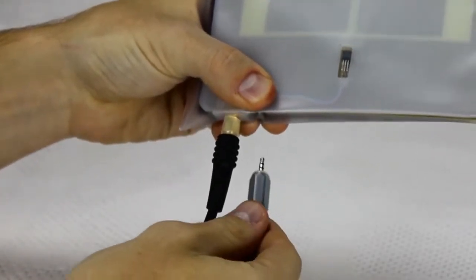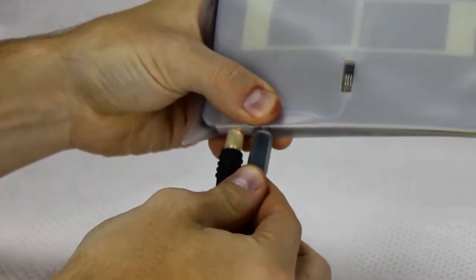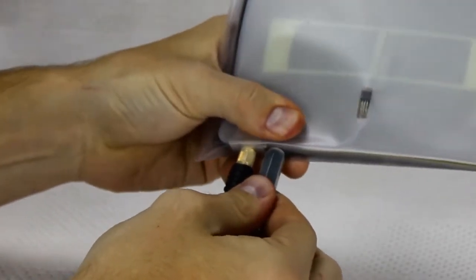To connect the gray cord, plug it into the hole next to the black cord. Next, connect the cords to the unit.